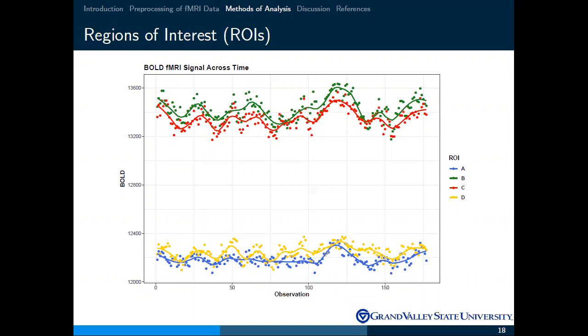Right. When I see those two, it almost looks to me like an exponentially weighted moving average, where the time that gets factored into the average is bigger. I mean, it's almost like that blue one just doesn't move as much. And when it does make a big move, then it does a bump, but not unless it's a big one.